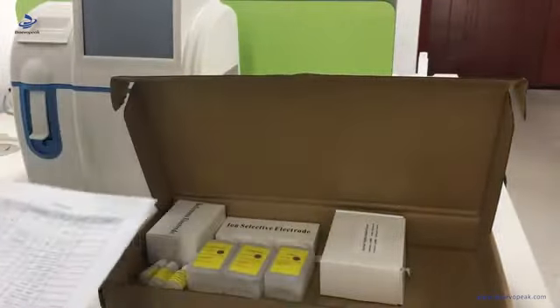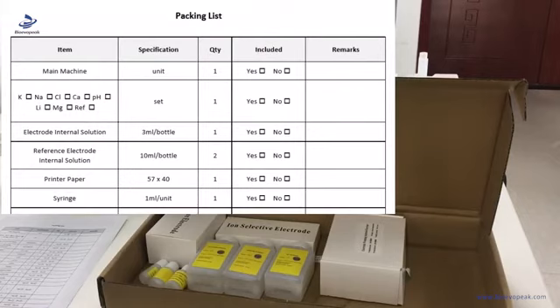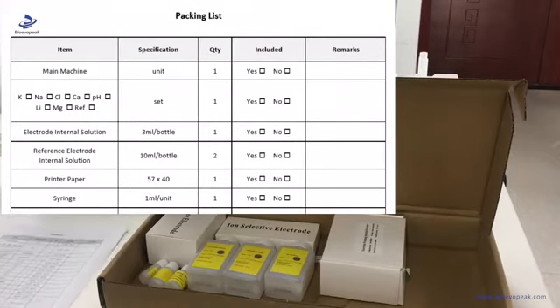Then we can open the accessory box and take out the packing list. Then we can use a pencil to check each accessory, reagent, and other items.